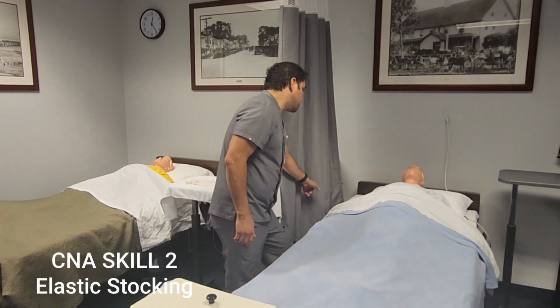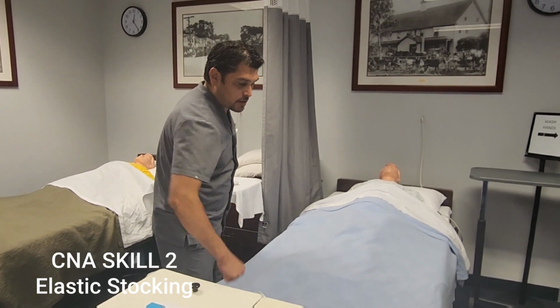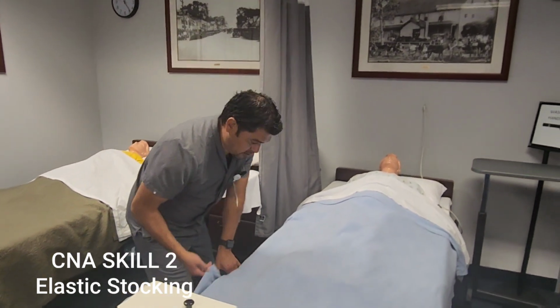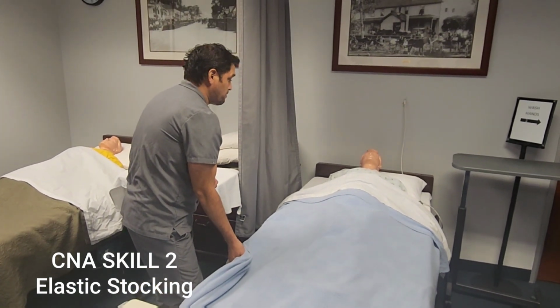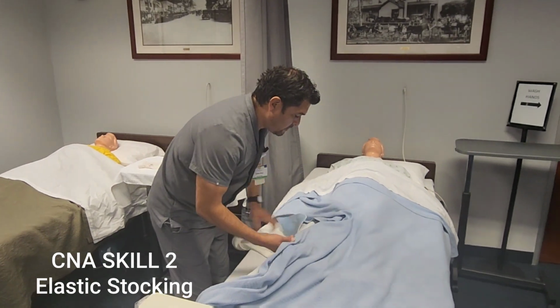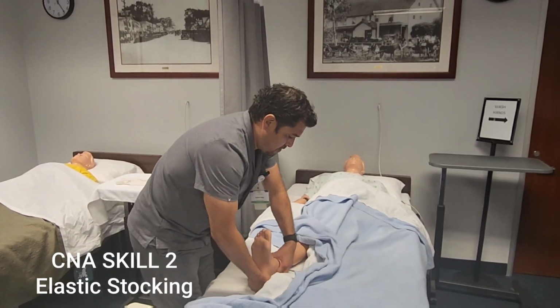And I'm going to get your remote and I'm going to raise you to my waist level, okay? This is a crank bed, and so I don't want to spend time cranking this. I'm going to just state that the bed is at my waist level. All right, now it is at my waist level, Mr. Jones. Real fast, what I'm going to do is expose the leg that I'm going to put the TED hose on, okay? All right, I'm going to go ahead and expose just the leg. I see he's got the draw sheet, and he's got his chuck underneath him. And now I'm exposing his foot.